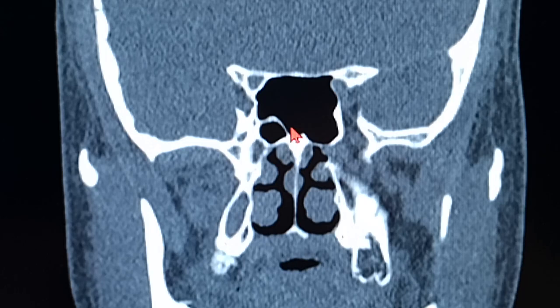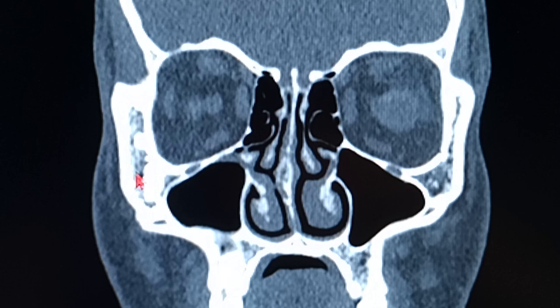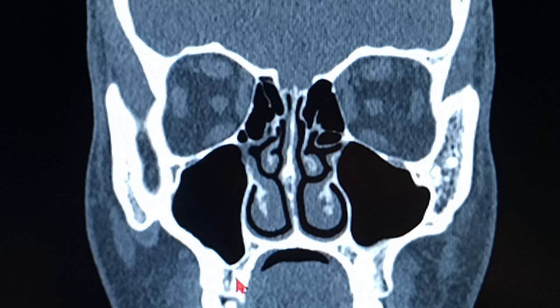What else is left? Skull-base dehiscence, CSF leaks. In this patient, all the skull-base bone is intact. Then that's the maxillary bone. You can see the dentition over here, in cases of cysts or abscesses having odontogenic origin. You can see a cyst or a tooth stuck over here. A lot of times you get cases like that. So you can have a basic CBCT, especially done for that. There is a cone beam CT for higher studies, so that gives you much more detailed anatomy. Dentigerous cyst and all those cases we keep on getting.